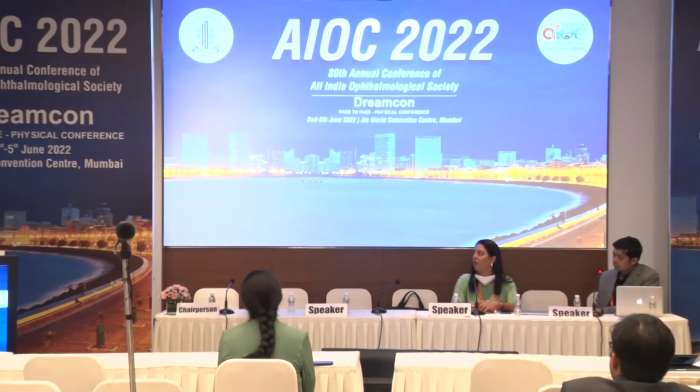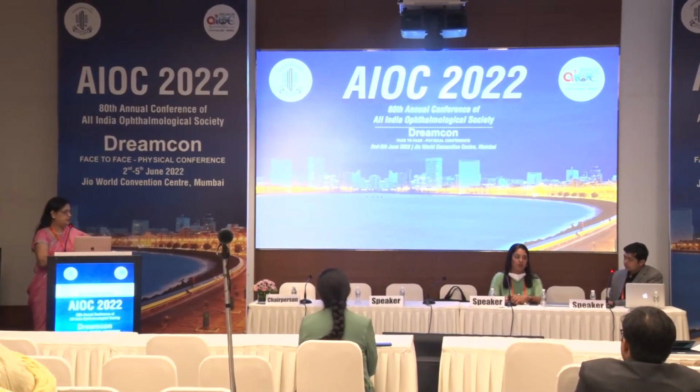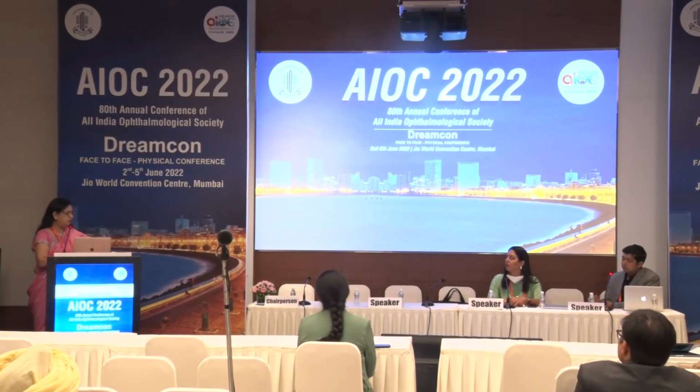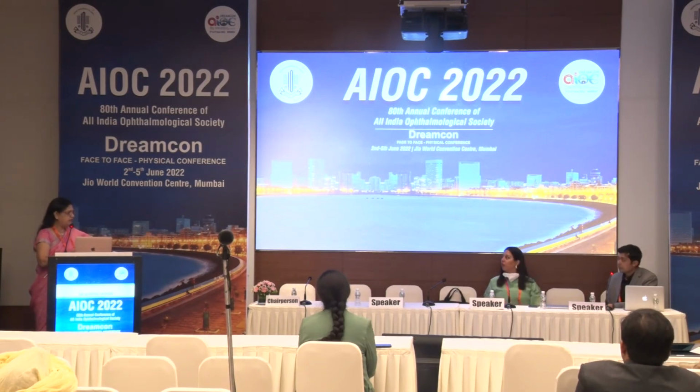Yeah, I would do it, because they can't be living the rest of their lives with compromised vision. So if it is in the visual axis and it's compromising the vision, whatever time they present, we'll have to lift the flap and definitely remove the epithelium. The later the striae present, the more you really need to remove the epithelium. If the striae is in the periphery, then probably you should look for other causes for the patient's discontentment. But otherwise, if you can see a clear striae in the center, you must go ahead and do it.